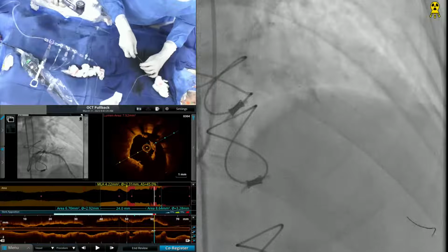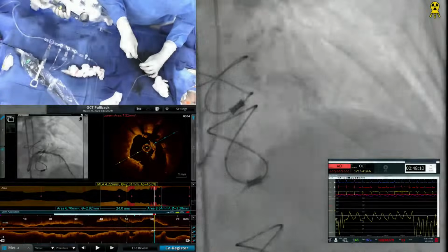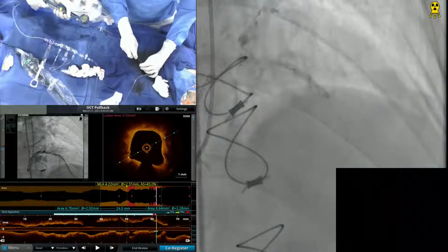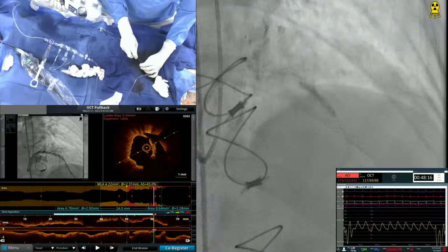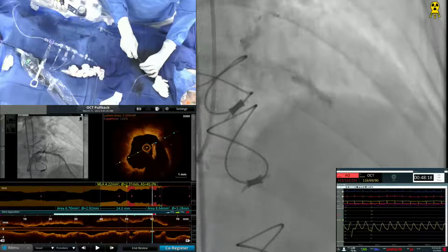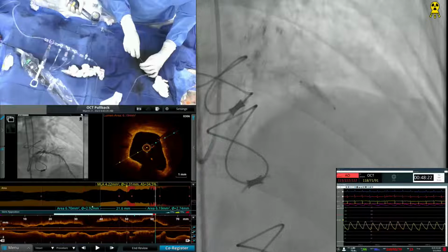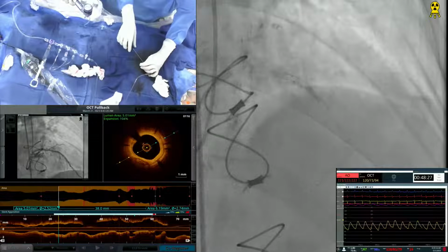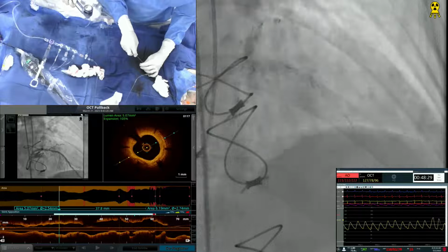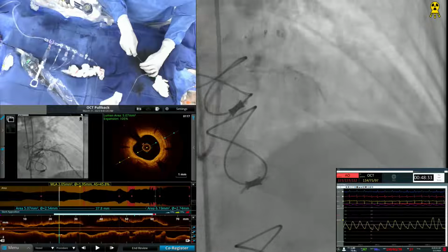Dr. Kinney, the double barrel starts at the ostial LAD, so I think it's better to cover the ostial. Ostial LAD, what's there? Yeah, there's a double barrel. Looks like a huge dissection. Yeah, we know that. Okay, give us the stent now. That is why even Rota was getting stuck. The wire was getting into that other barrel. We are going to touch that double barrel, okay?